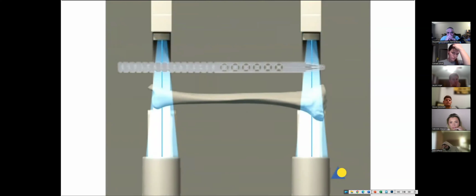The image intensifier is positioned for an AP or lateral X-ray of the proximal tibia. Using long forceps, the radiographic ruler is held parallel to the tibia on the lateral side of the lower leg. The ruler is placed so that its distal end is level with the required nail insertion point. The skin is marked on the lateral side.